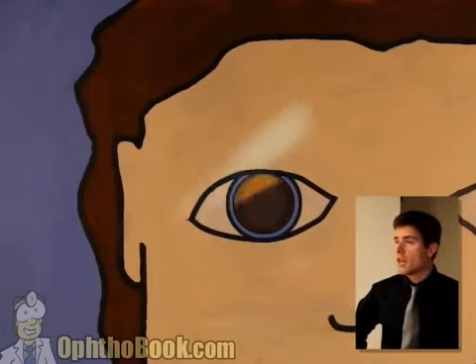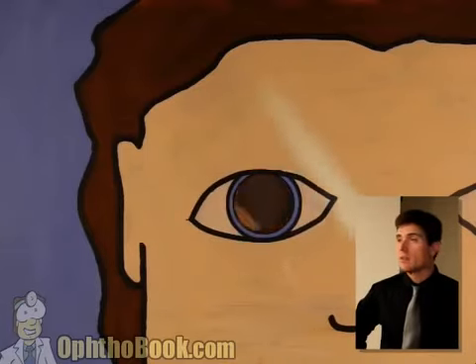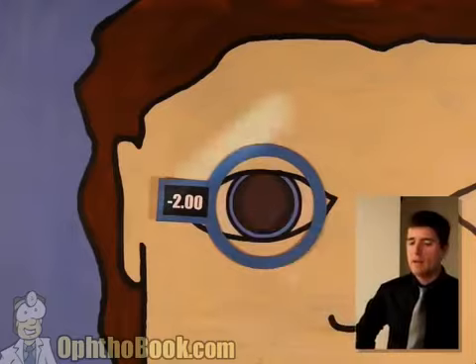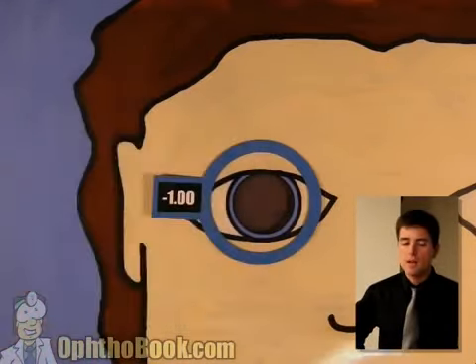It's a funny angle. Got to change. All right, good. We've got with motion in this direction. That's fine. We've got against. No, that's no good. We can't have against. You got to start with, or you're going to get confused. Let's throw a -2. Perfect. We've got with motion that way. We can continue. Let's add some more power to the system.